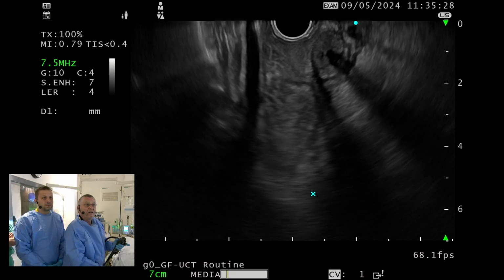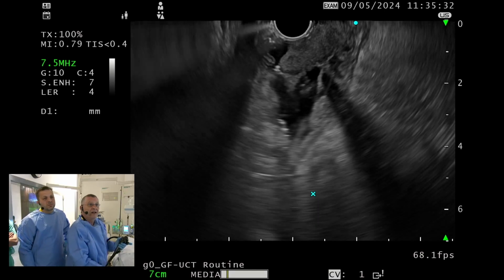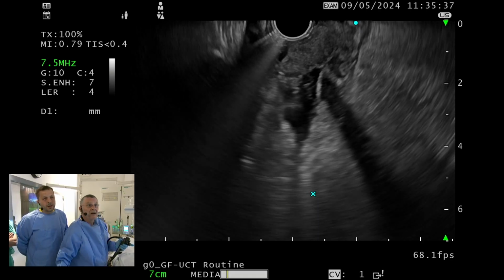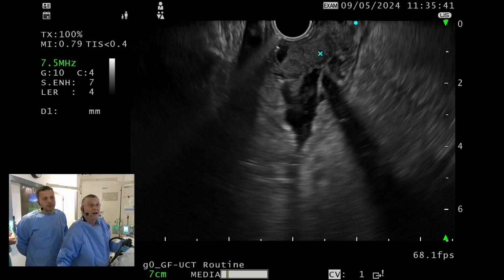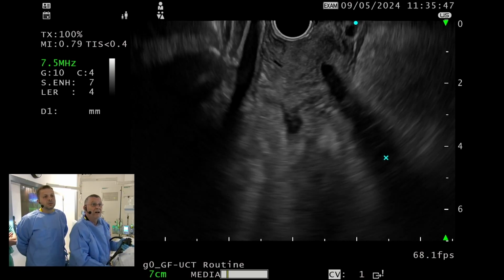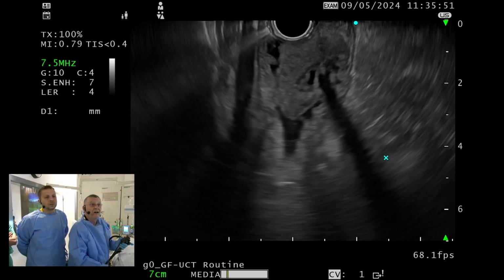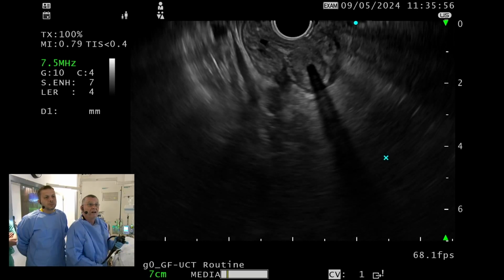Dr. Palazzo, can I ask a question, please? Yes. I always wonder about the ampulla, when I'm doing ampullectomy, is it a long common channel? Is it PD alone and CBD alone? Does it make a difference if I have a long common channel or a short one when I do ampullectomy? Do you study the length of the common channel?